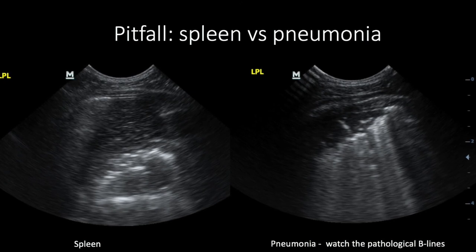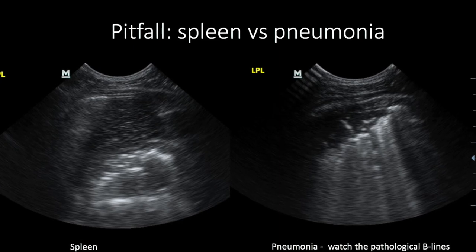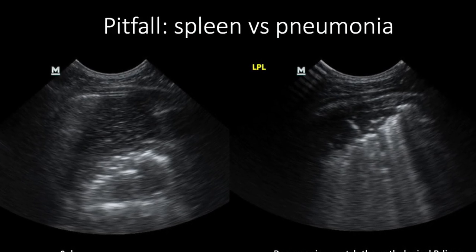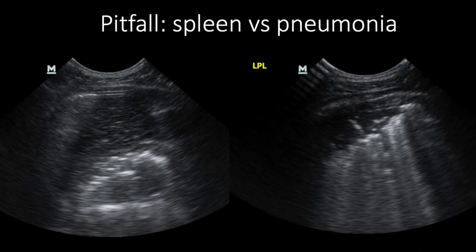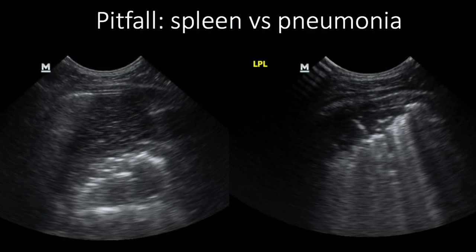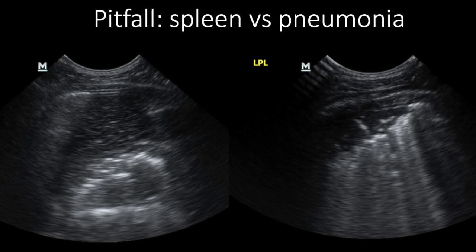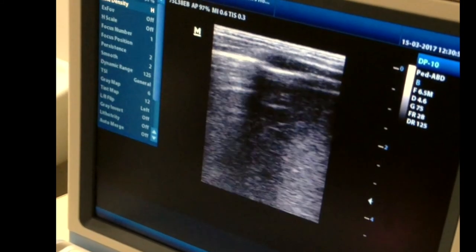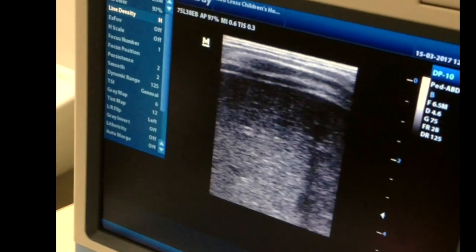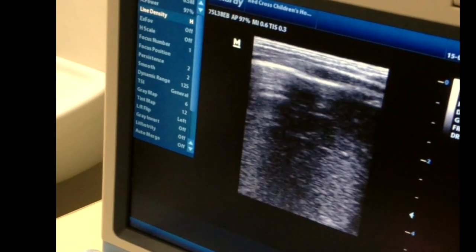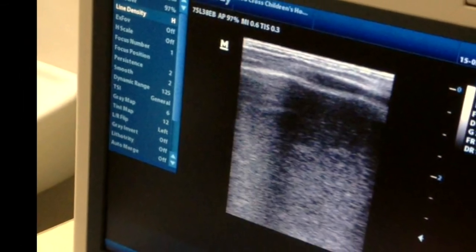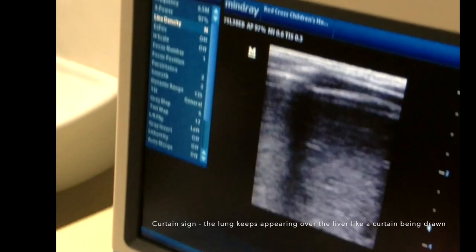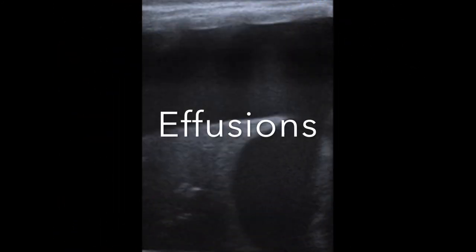These are some pitfalls. Sometimes looking at the spleen will look just like a pneumonia — you can see the spleen is dark and air in the stomach deep to the spleen looks like shredded B lines at the deep end of a pneumonia, very similar to the pneumonia on the right side of your picture. Always be aware when you are low in the chest and approaching the spleen or the liver so as not to call these organs pneumonia. That's not to say pneumonia cannot occur in the lower lobes. Scanning quite low on the patient you can see what we call a curtain sign — the lung comes into the picture as if drawing a curtain over the liver, showing a clear demarcation between the brighter aerated lung and the darker liver. I advise lots of practice in the lower lung bases to make sure you don't misidentify pneumonia.